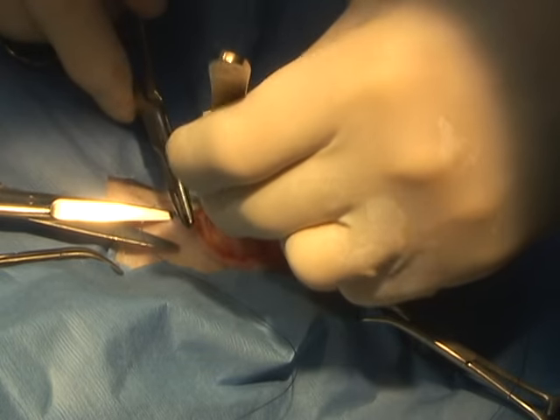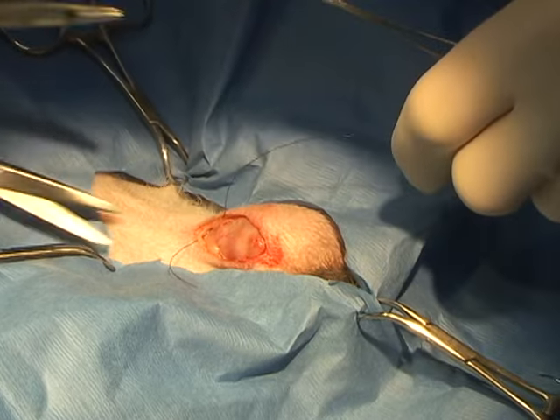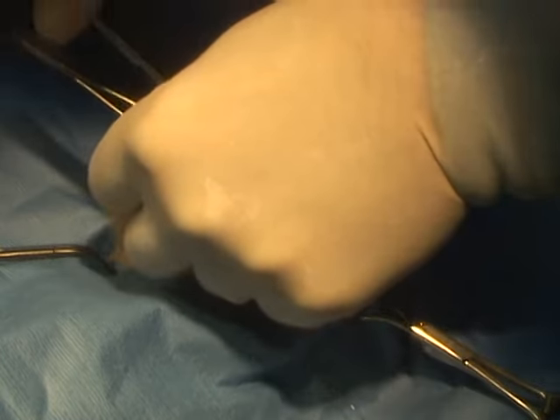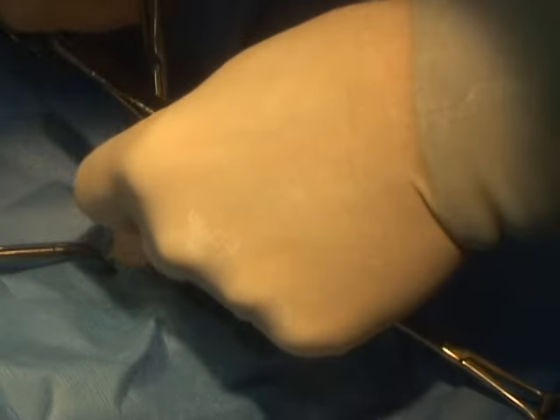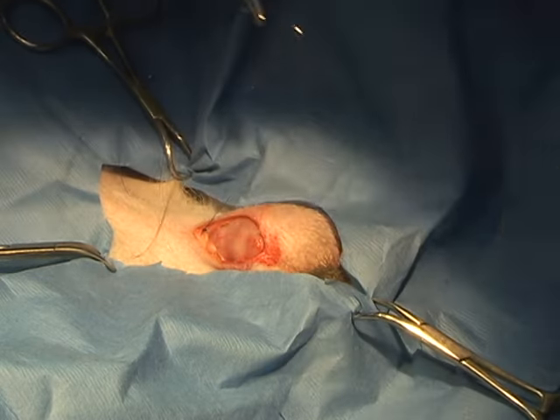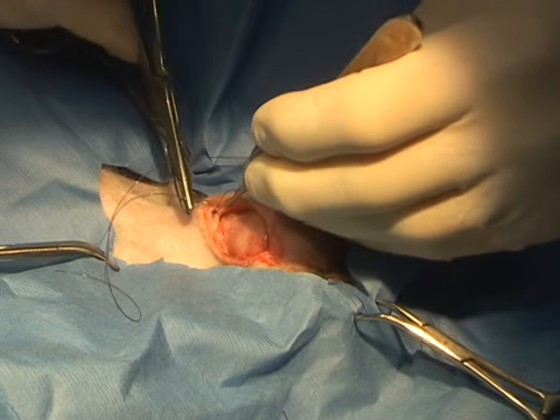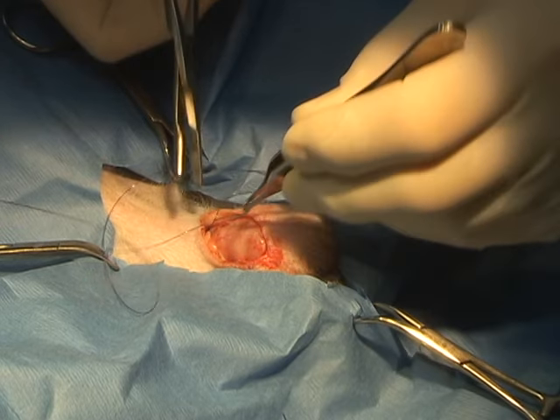Closure of the surgery is a subcuticular closure. We do a continuous suture anchored into the fascia and then close it. This way we have no skin sutures at all. Most of the dogs we do this on do not lick, itch, chew, or get any kind of edema postoperatively from the sutures. We kept him quiet for about 5 or 6 days after surgery, but again, all the swelling was down by the second or third day.